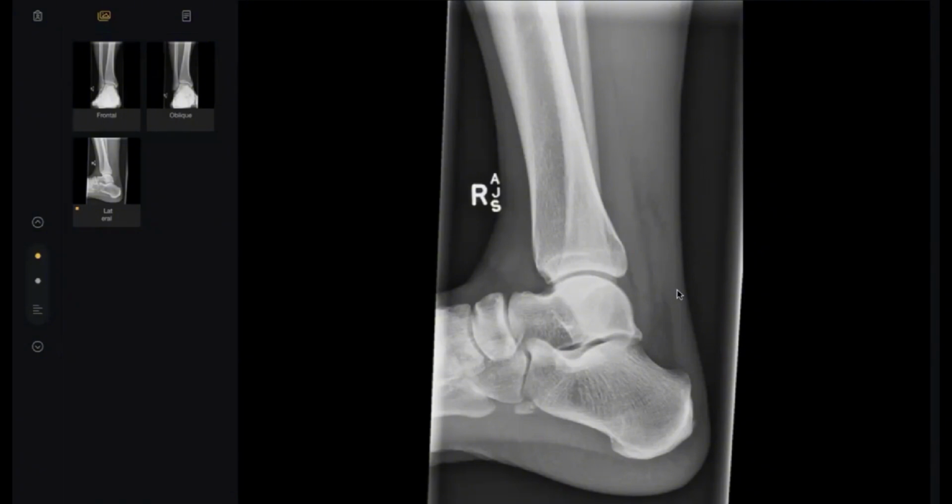If you told the examiner, I highly suspect a tear, and it is normal, he will not kill you. But if you missed it, really, he will give you zero in this case. Why? It is not an emergency, but very critical, very important, and very easy to be missed.